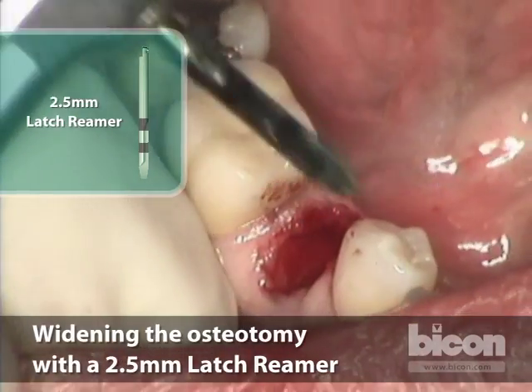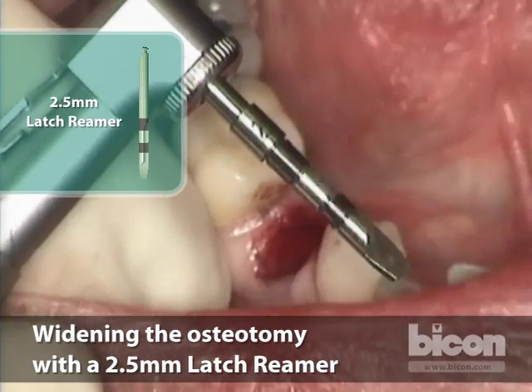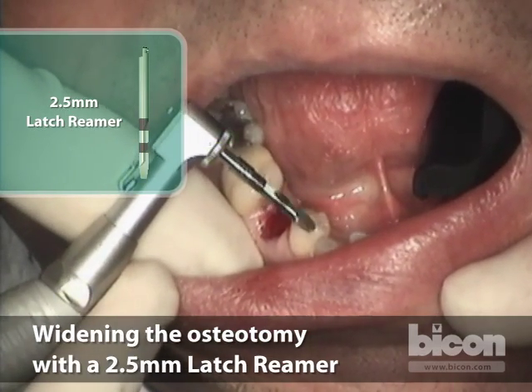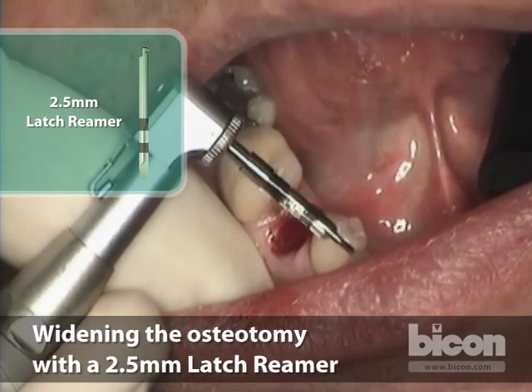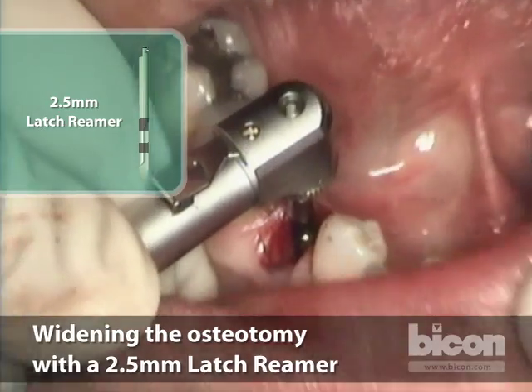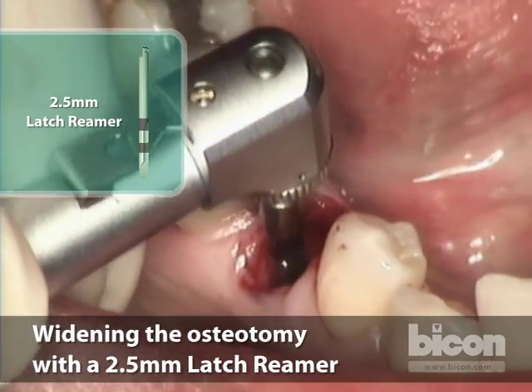From this point on we reduce our speed to 50 rpm or less, and use no irrigation because the speed is so low. The markings on the reamers are the same as the pilot drill: six to eight for the first band, eleven to fourteen for the second band. Two-handed technique again. We are going systematically through the sequence.